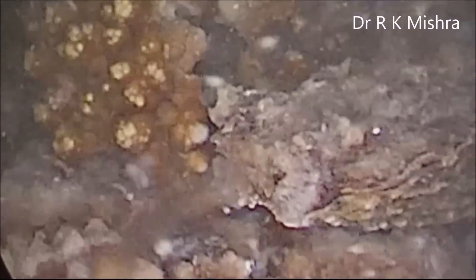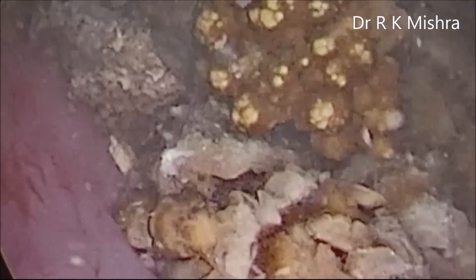Pneumatic lithotripsy works by the pressure of gas — an oxygen cylinder can be used. It has a piston to give single firing and multiple firing control.